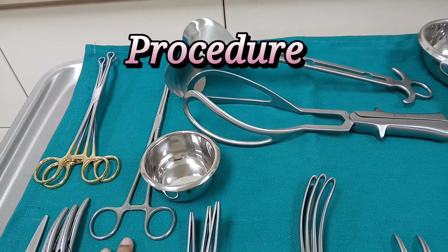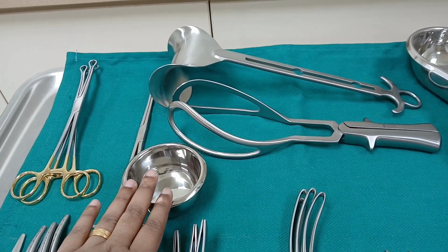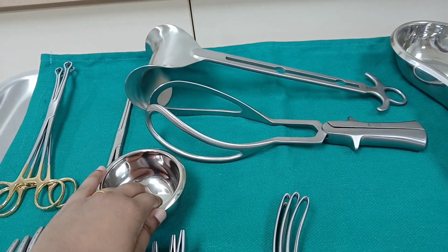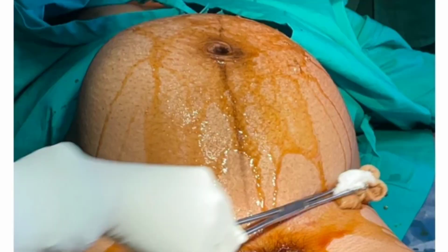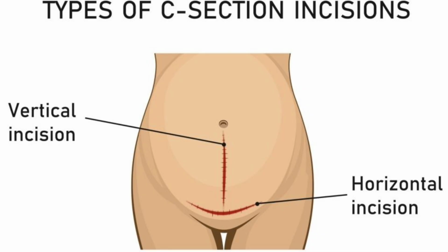How are we starting? First, we are starting with the cleaning. How are we cleaning? With the betadine. We are putting the betadine inside. Using gauze and a sponge holder, we are doing the cleaning. After cleaning, we are doing the draping. What is the meaning of draping? We expose only the surgical part. So after draping, the doctor starts the surgery.